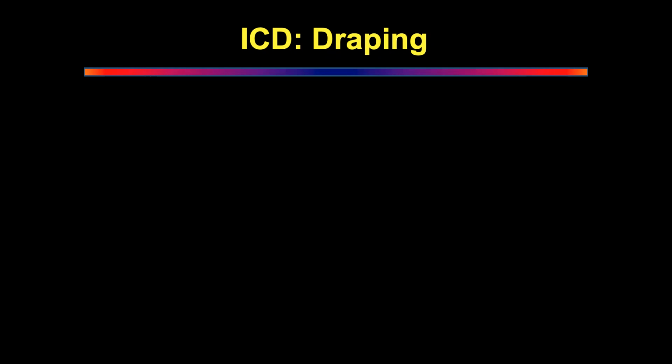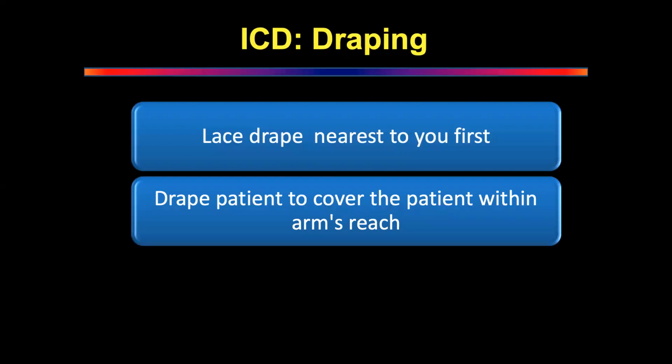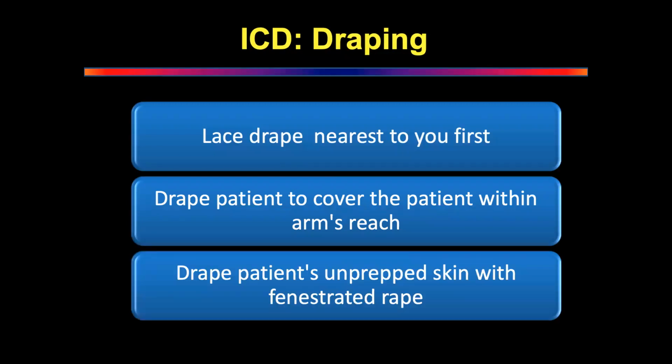If you have to put 4 drapes, which drape do you put first? Lateral drape along the posterior axillary line, which covers the bed, separates the patient from the bed. Away from you? Towards me. Towards the person. The first drape is always the one that's near you. Yes. Most important. The first drape should always be the one that's near you. Okay? And then you drape the other areas. Is that clear? Yes, sir.